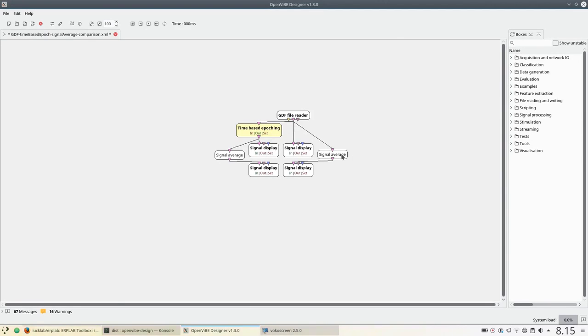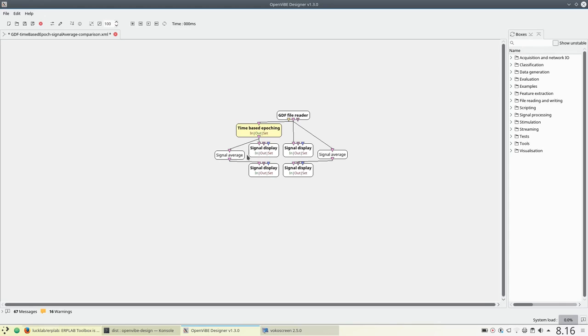I also average that signal for comparison and put it to its own display. On the time-based epoching side, we output that directly to the signal display and run it through signal average as well. That's going to give us more intuition for how time-based epoching compares with a raw and averaged signal.